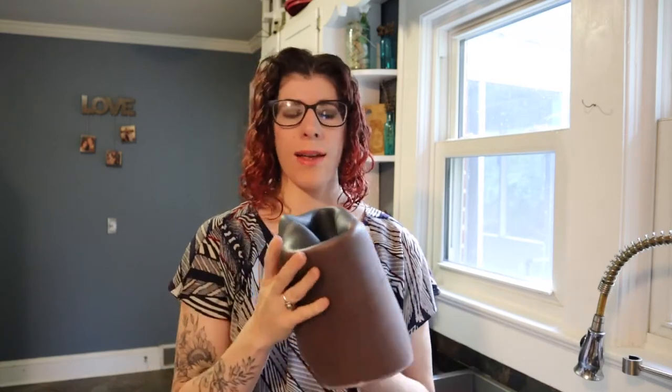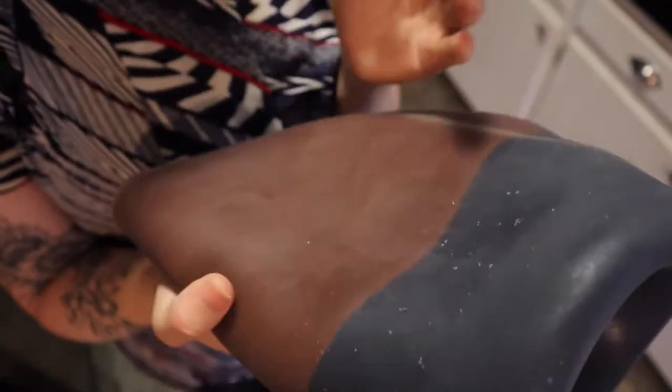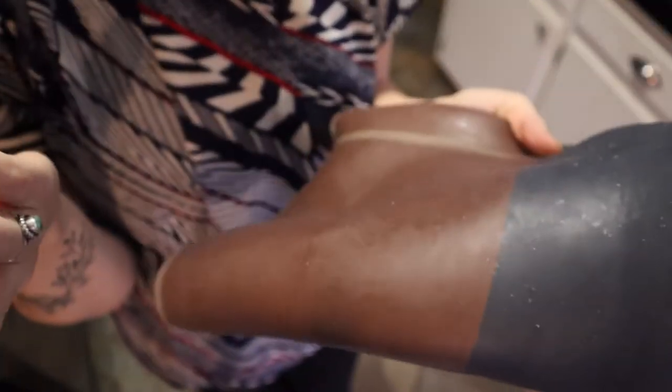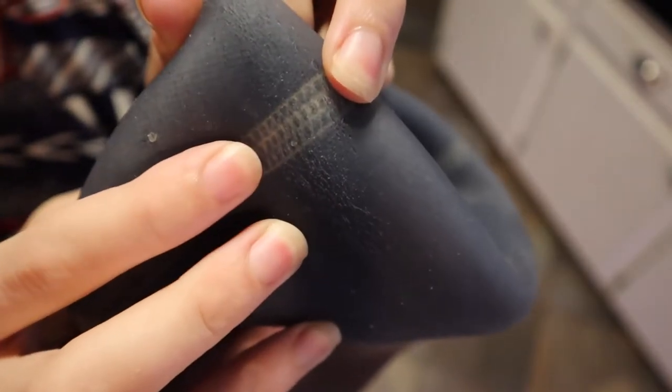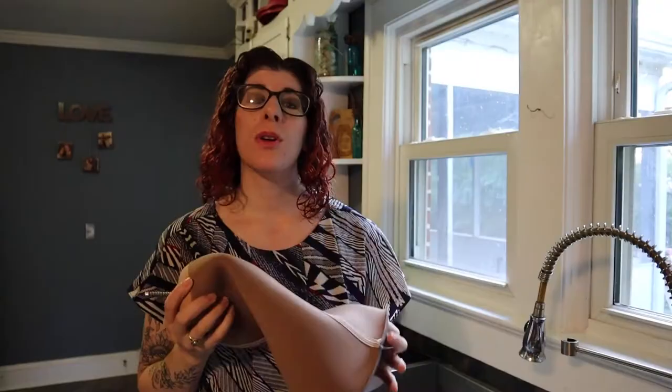You want to start by turning the liner inside out. You want to be inspecting the whole liner for any cracks or any discoloration. You can see this one is starting to dry out and get some cracking. If you are getting any of that cracking or any discoloration, that's usually when you want to replace the liner.